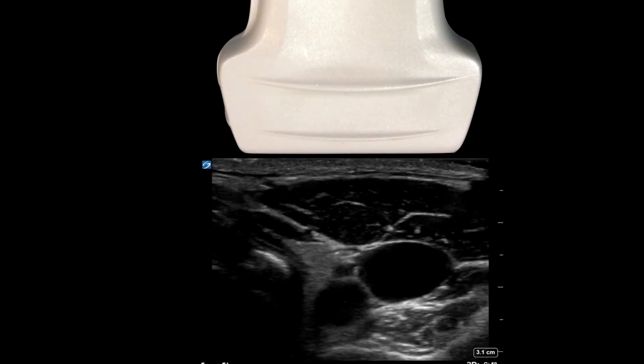When we talk about performing any procedure, you should set the room up and position the patient correctly so that you have the most success. When we go to do vascular access, this is particularly important. The first thing we want to discuss is that when you're going to do vascular access, we want to forget about this notion of where the probe marker has to be in relation to the patient, because it doesn't matter in correlation to the patient — but it does matter where it's directed in correlation to your image. Ignore whether the probe marker has to be to the right, left, or at the head.